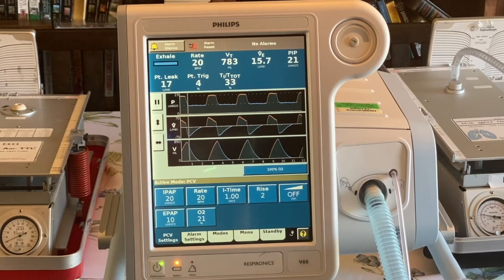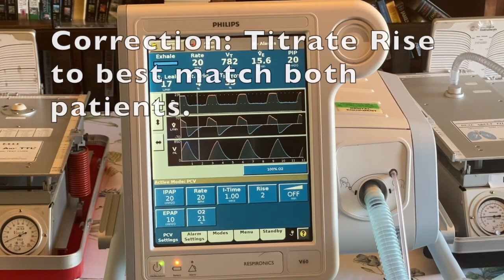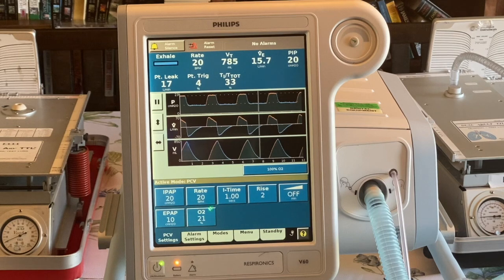The settings we've chosen to use — and I think these are reasonable settings to start with — are an IPAP of 20, which is a PIP of about 20. We have an EPAP of 10, which gives us a PEEP of 10. I started with a rate of 20 breaths per minute, an inspiratory time of one second. We used a RISE of 2 right now; however, you can titrate that for the individual patient. I would definitely turn the RAMP off and set the O2 at whatever is appropriate. Right now I don't have the ventilator connected to 50 PSI O2, so I have it on 21%.